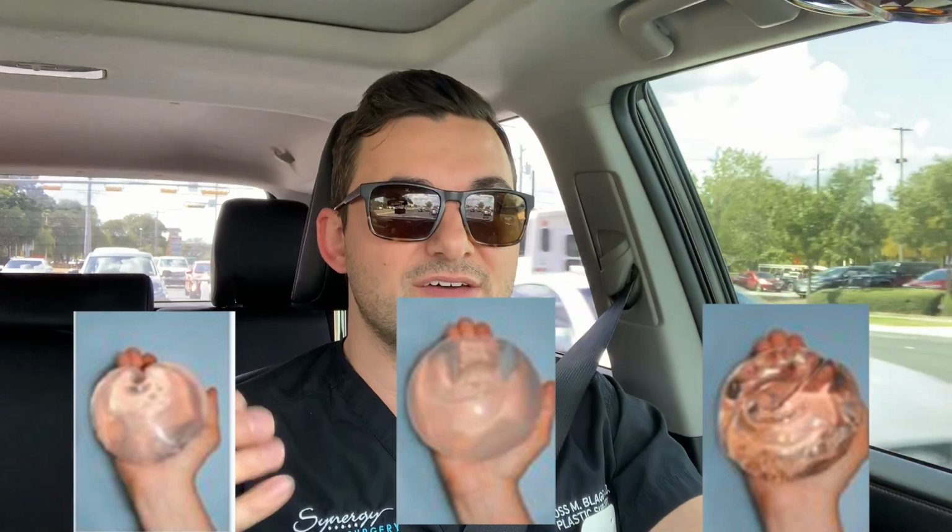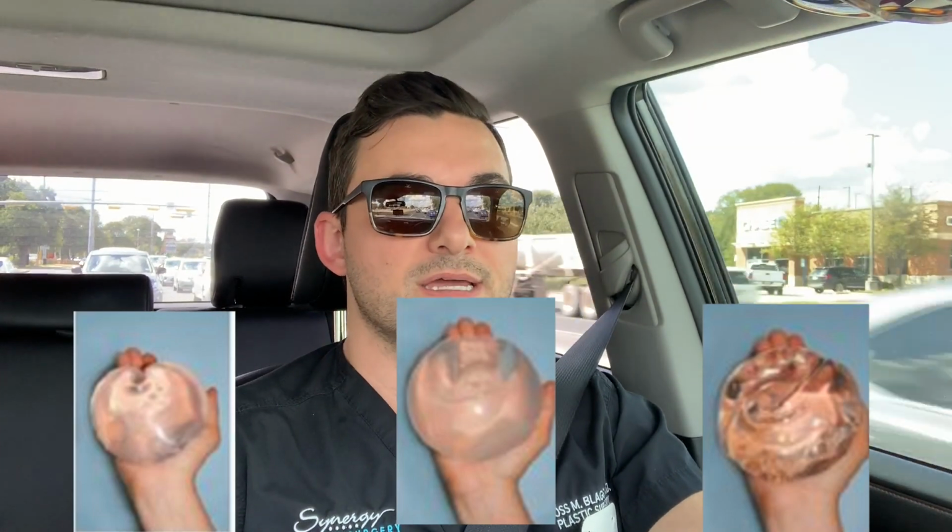So, you know, good to do your research to know what different types of implants are out there and available. You've got your saline implant, silicone implant, and now the Ideal Implant is kind of an in-between and can give you kind of the best of both worlds depending on your goals with getting breast augmentation. But if you'd like to talk more about the options for that, then just see your local handy plastic surgeon.